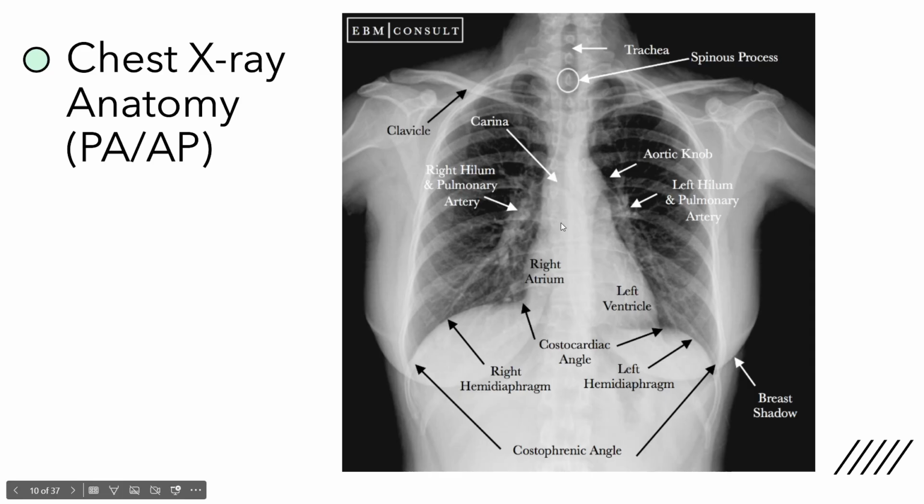We also want to look for the main bundle of vasculature on either side. Generally it looks like a finger or maybe like a tree sprouting within the lungs on either side. So this is the right hilum and the left hilum. There's one on either side.